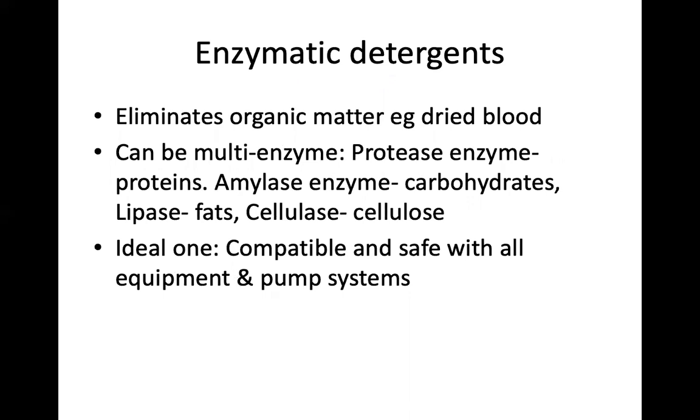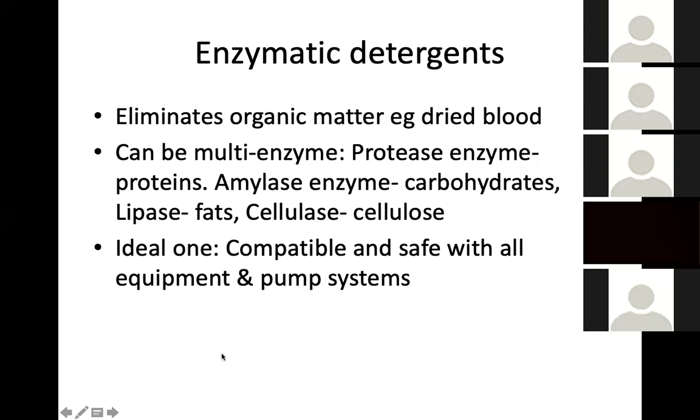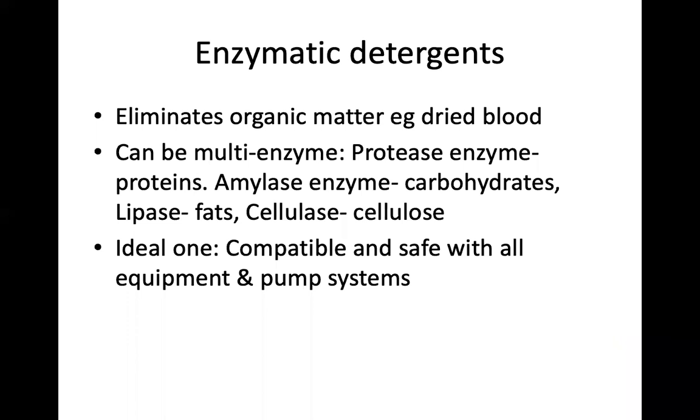These enzymatic detergents are basically detergents that have enzymes: proteases that can break down proteins, amylases that can break down carbohydrates, lipases that can break down fats, and cellulase that can break down cellulose. Okay, these detergents can be diluted in water and used to wipe down floors, walls, or environmental surfaces, or you dilute them in containers like buckets and soak your items like forceps or any other device that could be contaminated with visible organic matter. You soak them in the detergents, then you take them through the process of disinfection or sterilization, okay?